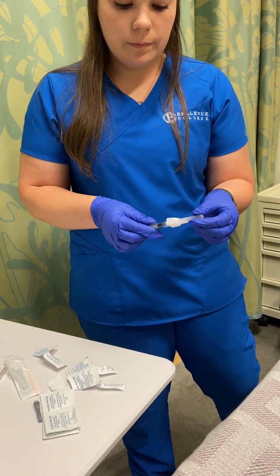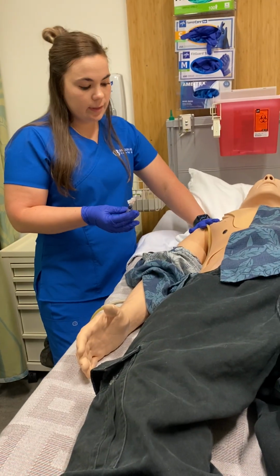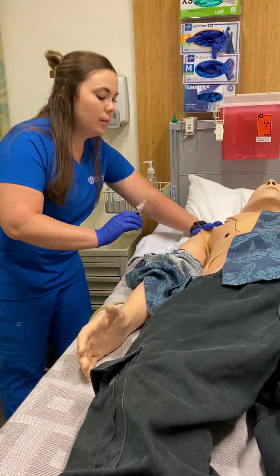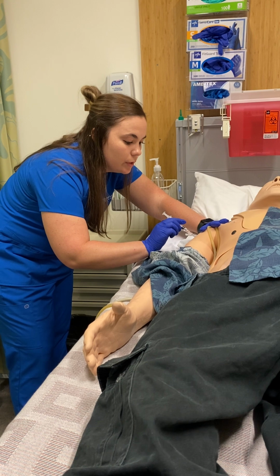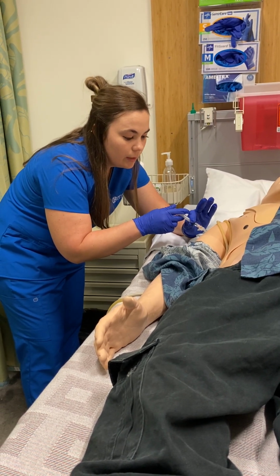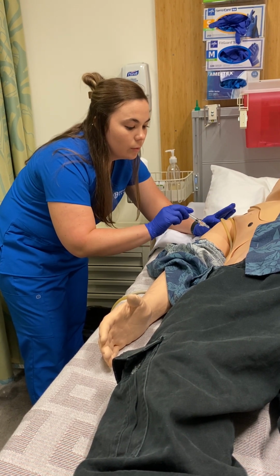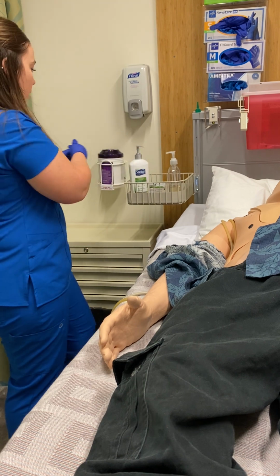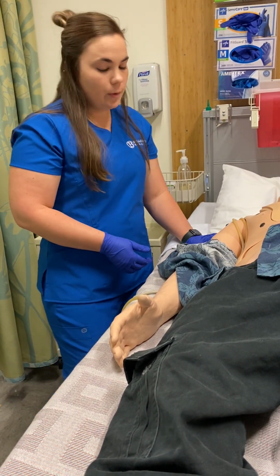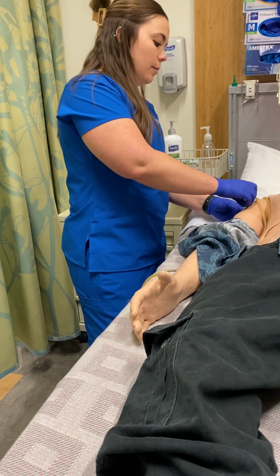Uncap the needle. You'd want to pull the skin tight here if you're not using the Z-Track method, and insert using a dart-like motion. You'd want to stabilize the syringe using your non-dominant hand and administer the medication. You'd withdraw, activate the safety device, and then put it into your sharps container. Hold pressure on the site to make sure it doesn't bleed, and put on a band-aid.